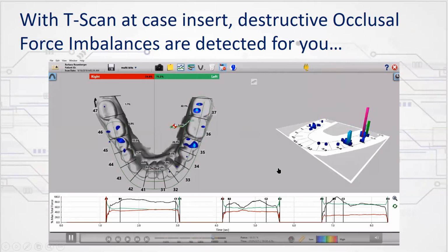It's very clear the left side is way too early. The right side barely doesn't make contact except in one place on the 4-6. And in order to deal with this, it becomes very clear where the problems are: the distal lingual cusp of the 3-7, the mesial lingual cusp of the 3-7, and the buccal cusp of the 3-5. And that's how you begin to improve the outcome. And I'll show you a case of how you sequentially improve the outcome a little later in the presentation.